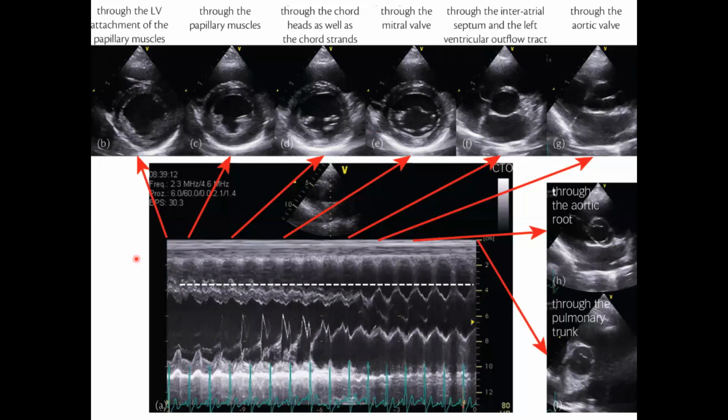It's done not only in echo, it can be done in MRI and not so much in CT, but you could do it. But in MRI, you can excite a cylindrical volume of tissue, and it doesn't take long to put a frequency encoding pulse across that line and watch it move in real time, right?